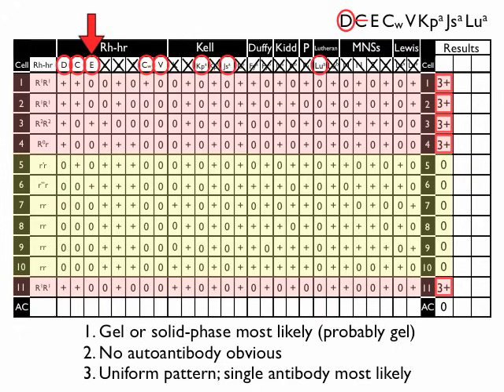Okay, with that being said, now we're on to a group of antigens that everybody wonders about. We've got things like Cw, which can be more present, but you've got V and Kpa and Jsa and Lutheran a, all of which are very uncommonly even present on an antibody panel. And you're not going to be able to rule them out on most antibody panels because there's nothing present to do rule outs or cross outs with.